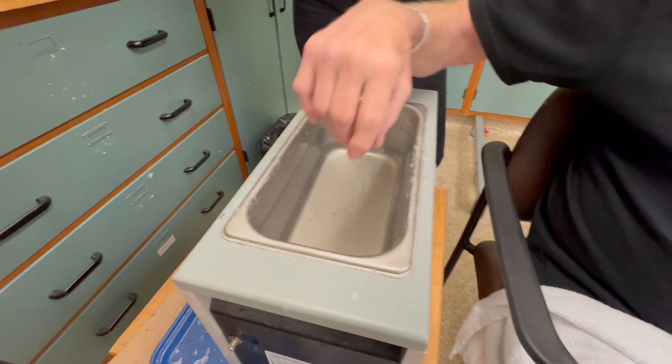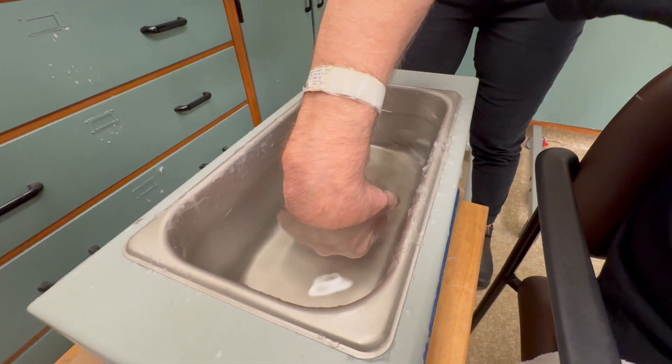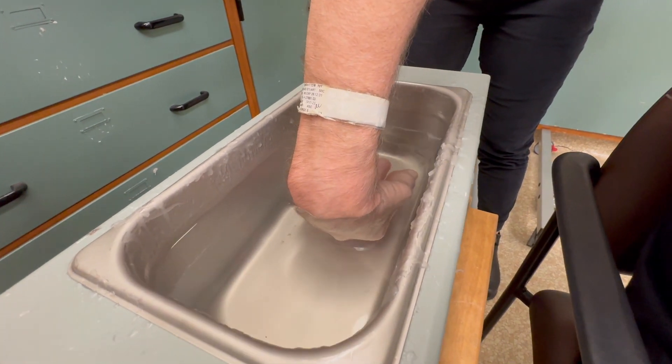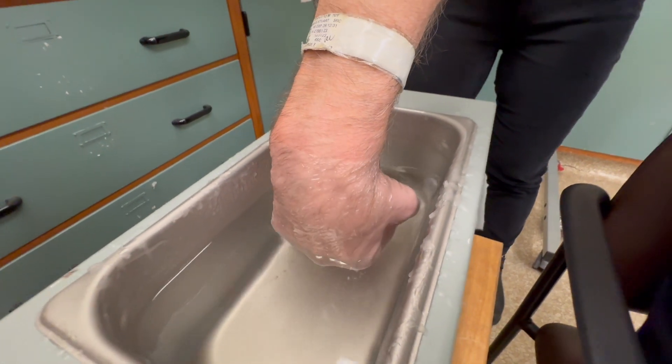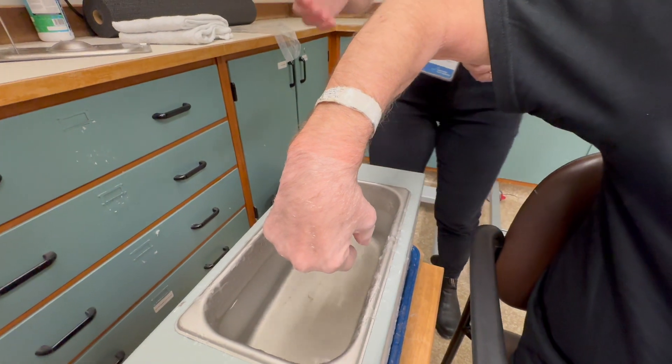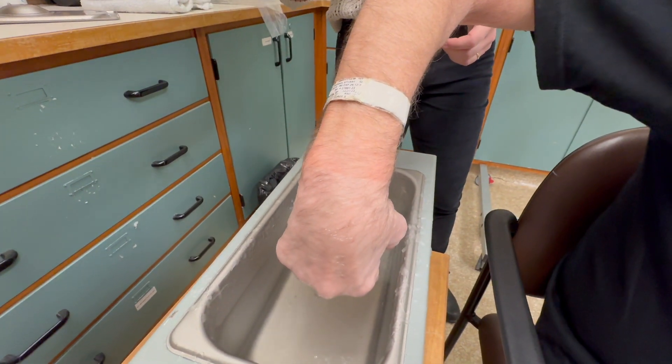This is paraffin wax. This is what we're going to be using to treat Mike's hand. The bottom is really hot, so I'm going to avoid the bottom, stick my hand in, get it up to about the wrist without touching the bottom, and then pull it out. Let it harden a little bit. Try to keep your fingers spread a bit so it forms a glove.